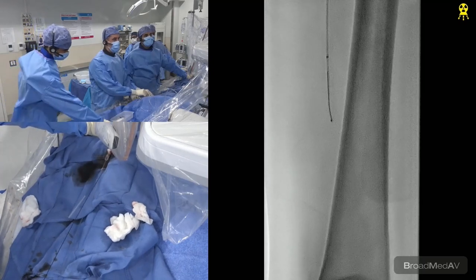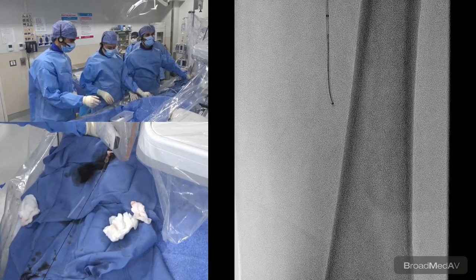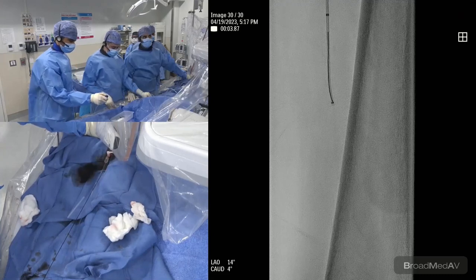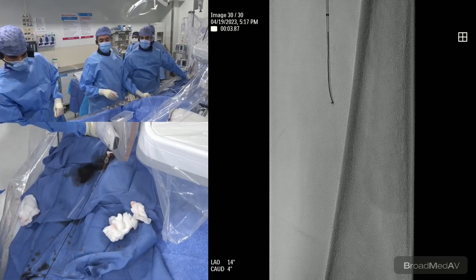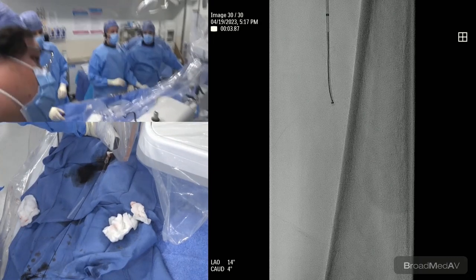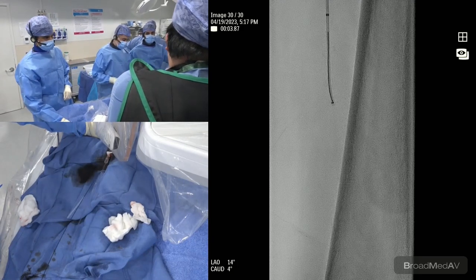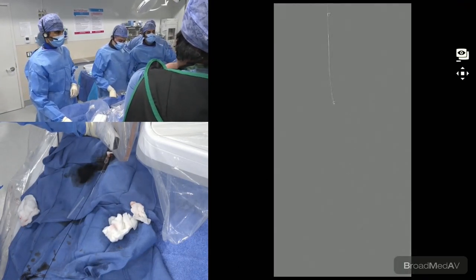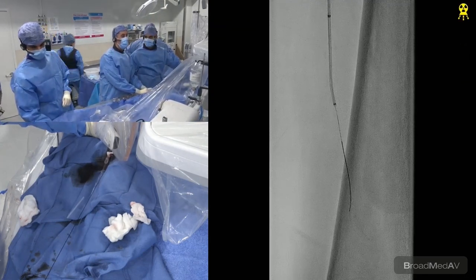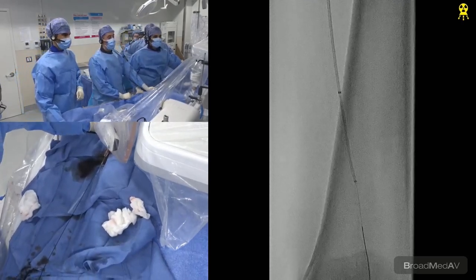So what we're doing now is we're just pulling this up. You need to get a little closer with the catheter. So Raman's just going to get the catheter closer. And Vishal, now he's probably just going to push it through. One second. And then we're going to set up an IVUS, to understand how it is. So right now, he's going to go with an intravascular ultrasound catheter once he crosses this wire. So you can see we're using an 014 hydrophilic wire, which I think is the good wire for us to start in this particular type of lesion. And then what we'll do is once we cross, there you go. So he's already crossed.